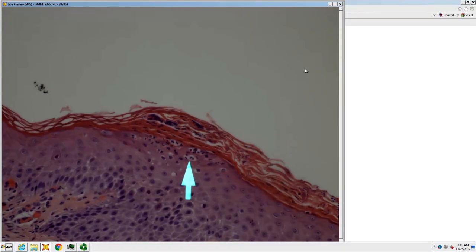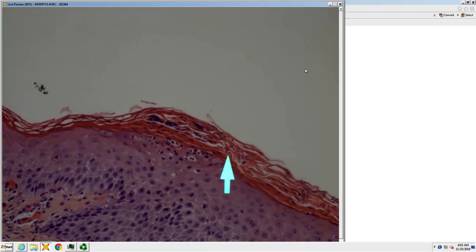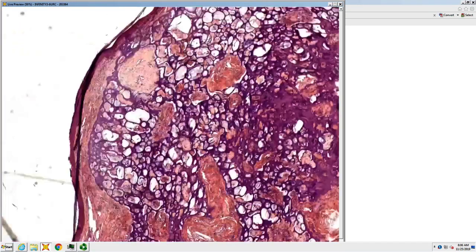Candida? Yeah. Neutrophils in the horn, spongiform, you see vertical, and they're too thick, too wide to be erythrasma. So sometimes you can see that they're hollow or that they're also yeast or buds, and that can help. Okay.